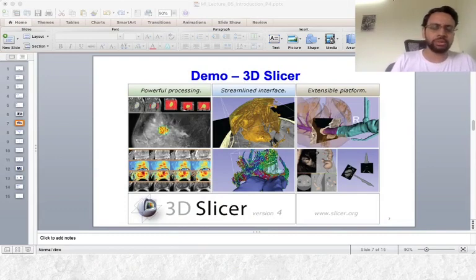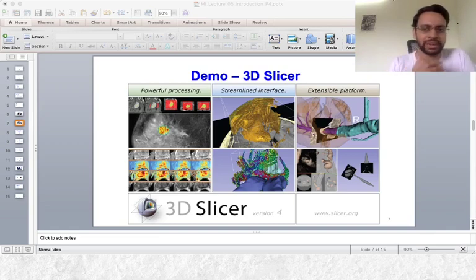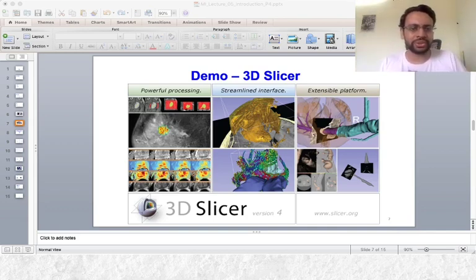And now if you want to do very serious programming in medical imaging, one of the best tools and my favorite tool is Insight Segmentation and Registration Toolkit. It's an open source cross-platform library, and this is a widely used one. And two tools that we have seen, ITK-SNAP and 3D Slicer, are built upon this tool.